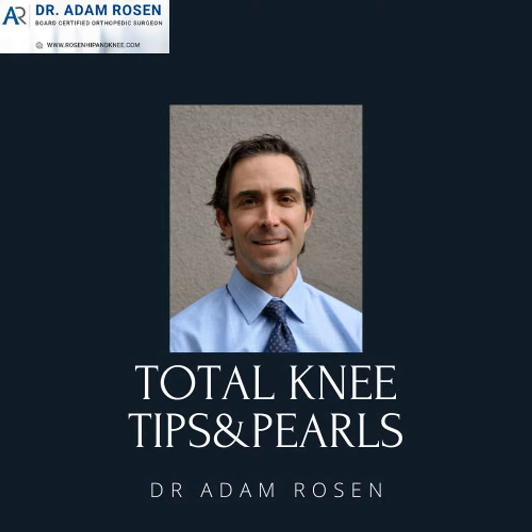So again, I'll put this all in the show notes, but type 1, minimal bony defect, pretty much fill it with cement or impaction grafting, doesn't compromise the stability of your implant. 2A, 2B, metaphyseal bone damage, but 2A is one side, one condyle, one half of the plateau, medial or lateral. 2B is metaphyseal bone damage, but both condyles, both femoral condyles, both sides of the tibial plateau. And 3 is massive bone loss. Those are the ones you've got to be prepared for.